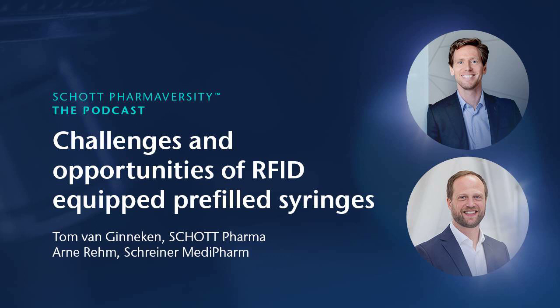Yeah, of course. First example is inventory management. A smart syringe can be monitored during the storage and transport steps in a hospital. So there's perfect transparency of what kind of drugs, in which kind of amount, where are they available. So this makes, first of all, the automatic replenishing much easier without having to make up inventories. But also, for instance, drug diversion can be combated.